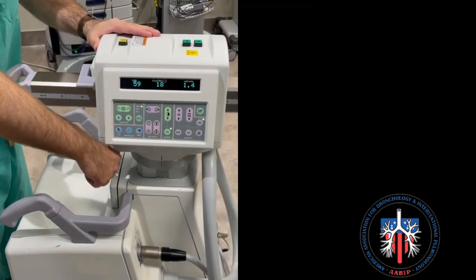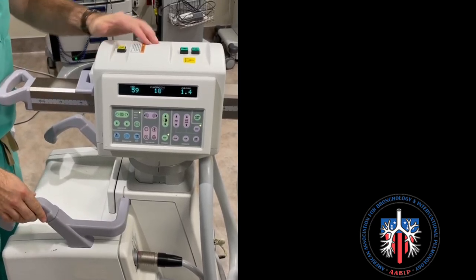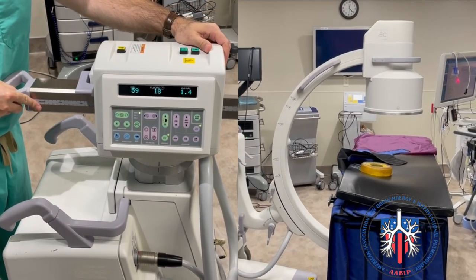To pan the C-Arm cephalad to caudad, pull this lever and carefully move the C-Arm caudad and cephalad as shown here.